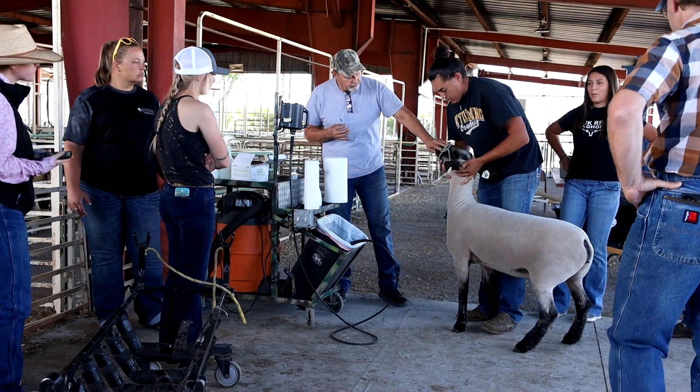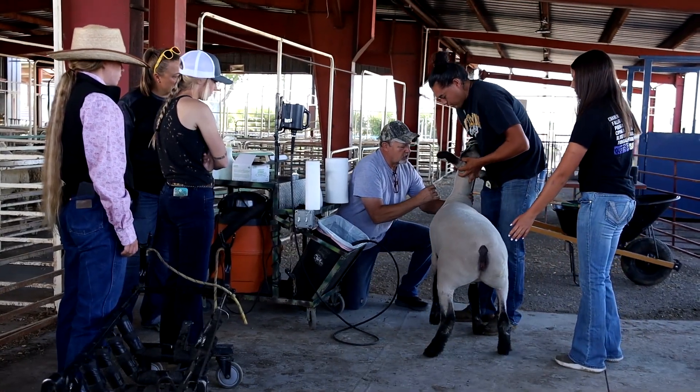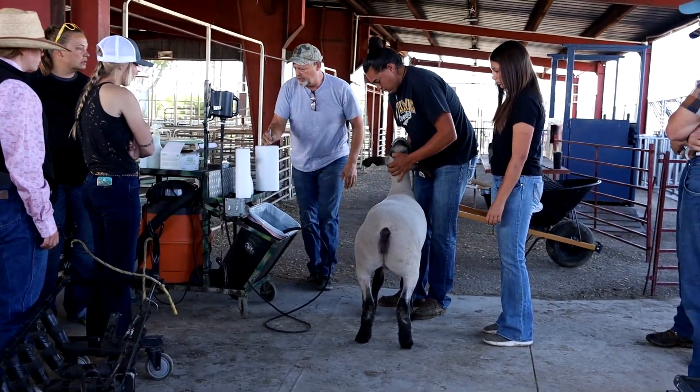When you grab them, just hold under their chin like this and somebody will come to IV here, find that vein and get blood, then pull it up and give it just a little bit.